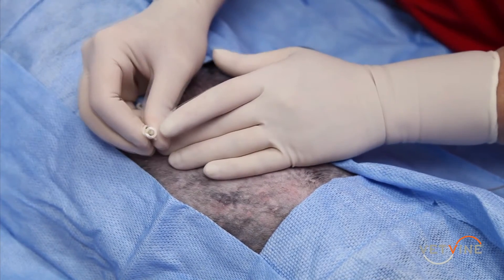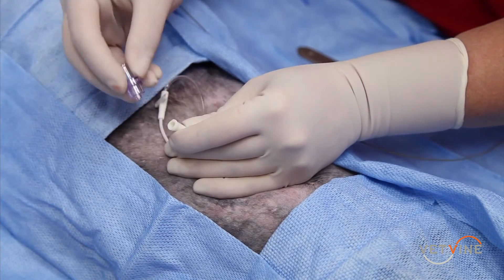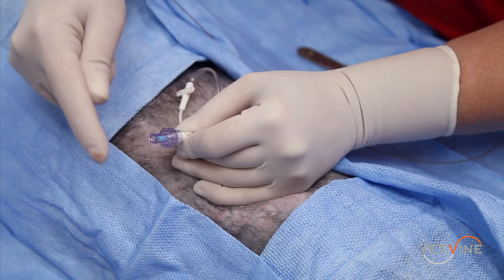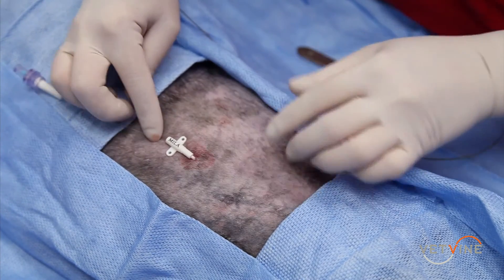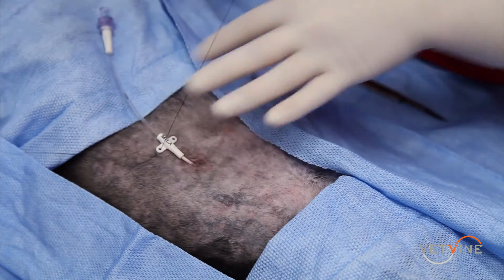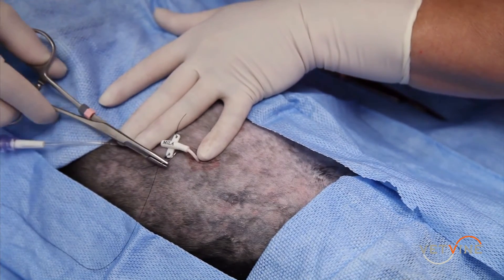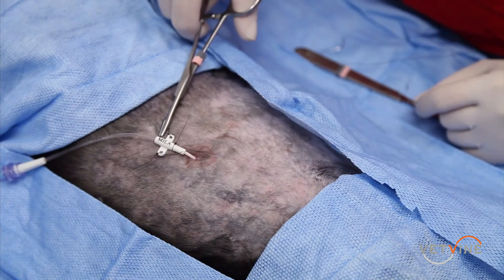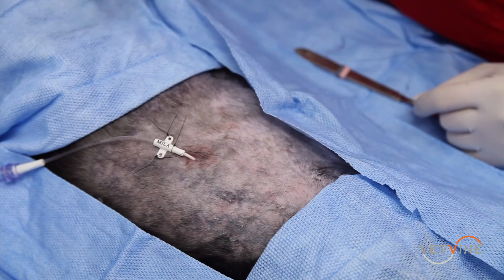Fluid will then leak from the pleural space, or you can immediately attach the adapter by securing it into place, noting that the adapter has a valve to prevent air from leaking into the thorax. Once the catheter is in place, there are two methods for securing it: first, secure the catheter to the skin using the butterfly flange; and second, securing suture into the grooves around the hub of the catheter itself. The catheter is then secured in place and can have a Telfa or light gauze placed over it and bandaged to the thorax.